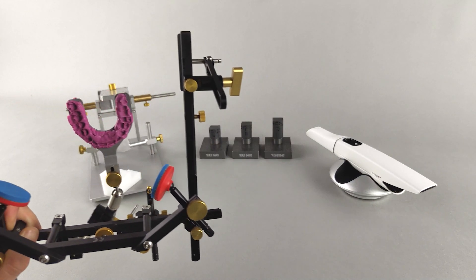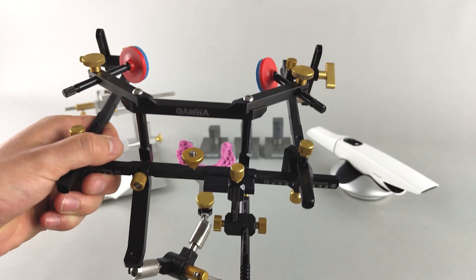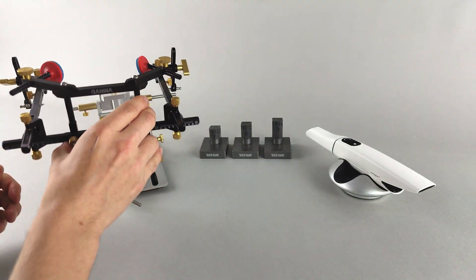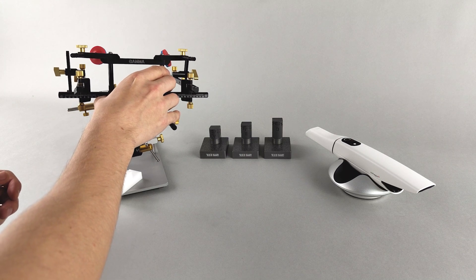Using the Kinematic Face Bow's Condylograph and Condylograph Comfort, the upper jaw position can be transferred in relation to the exact kinematic hinge axis from the patient to the upper jaw transfer stand and subsequently to the articulator.